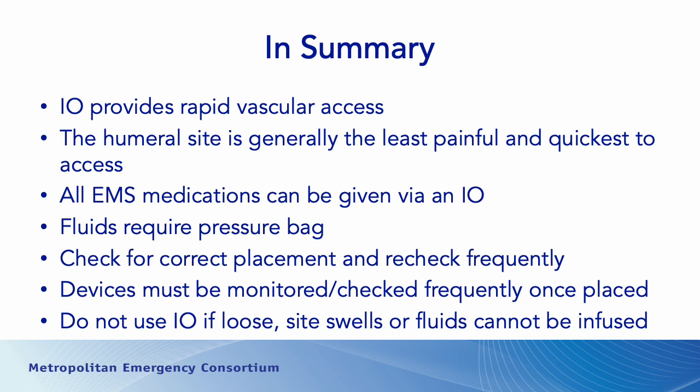If you're going to give fluids, they do require a pressure bag, particularly for the tibia. If you place an IO, you should check for the correct placement, and you should recheck frequently. It's something that you should check several times during your transport, and my suggestion is you also check it on arrival at the hospital so that you can verify it's correctly placed. So if there's any problems afterwards, you're in a good position to say, hey, I checked it and it was okay.